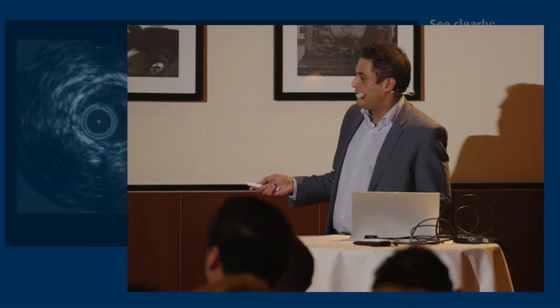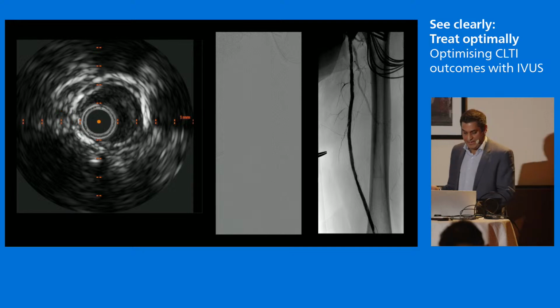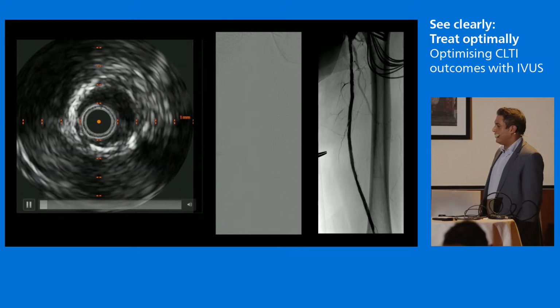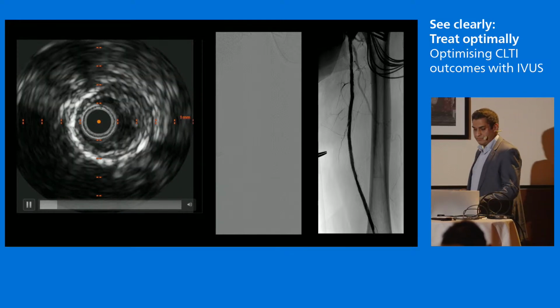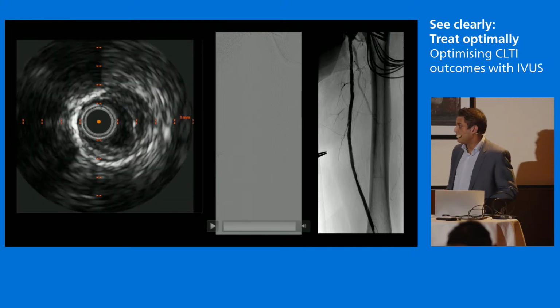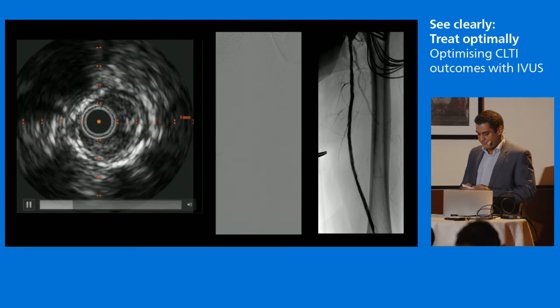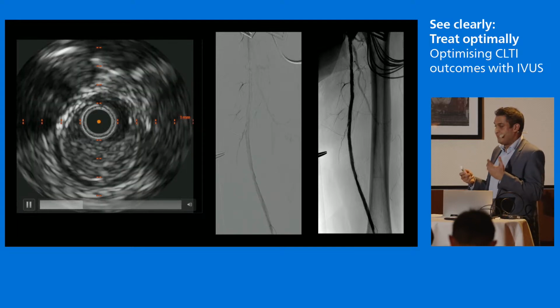So, I'm going to go back to that run. So here's that run that I showed you, the pullback I showed you earlier, where there's this odd speckly flow within the lumen. Just there. And you can see the angiogram just about. The emptying is quite slow.